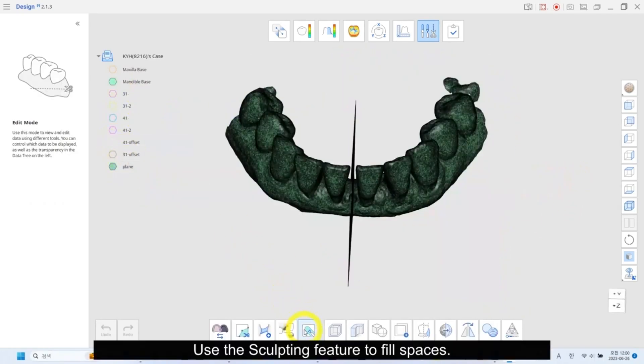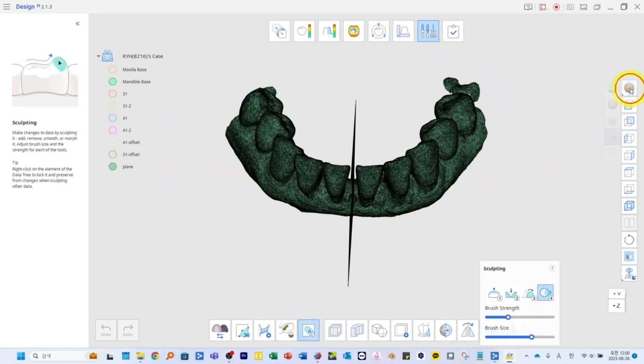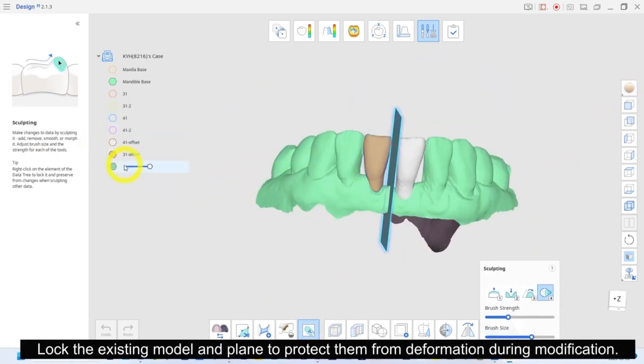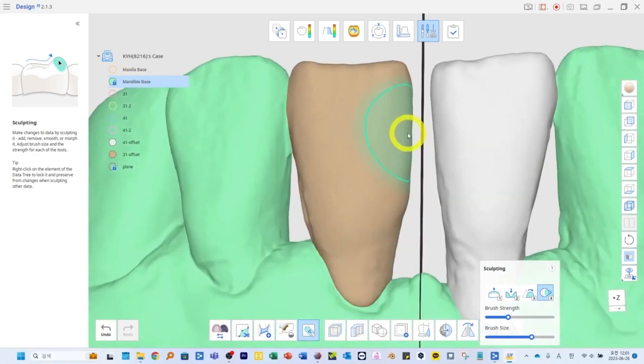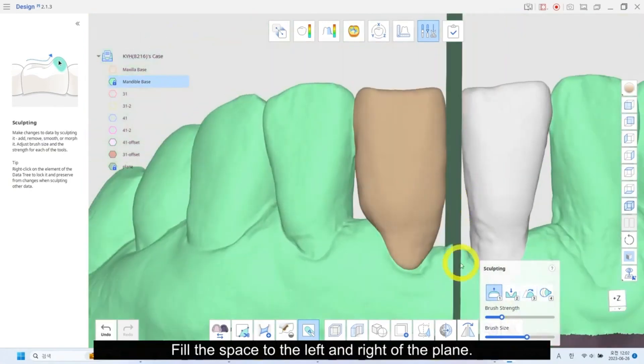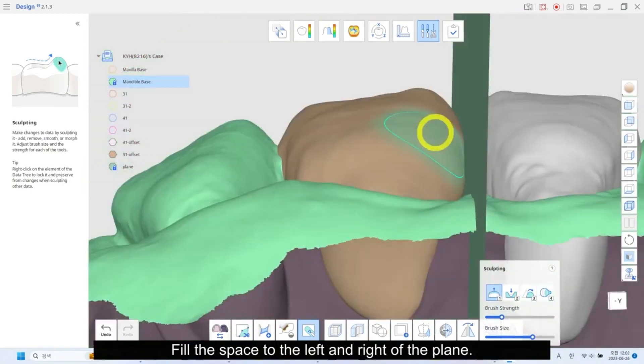Use the sculpting feature to fill spaces. Lock the existing model and plane to protect them from deformation during modification. Fill the space to the left and right of the plane.